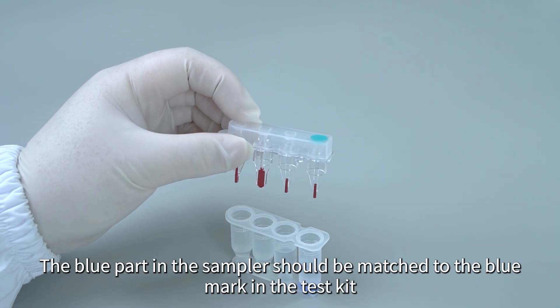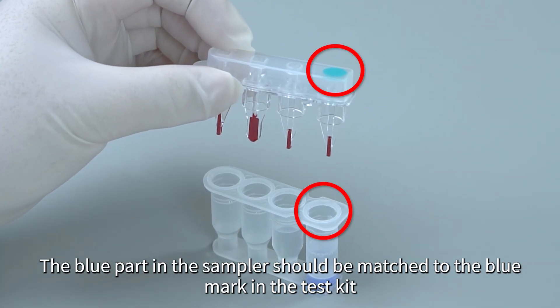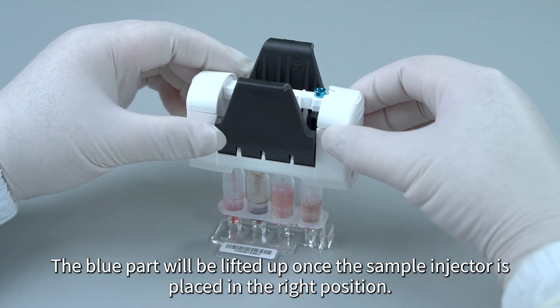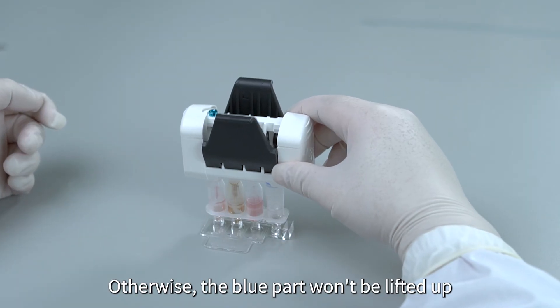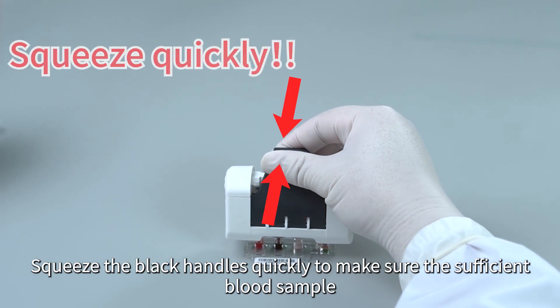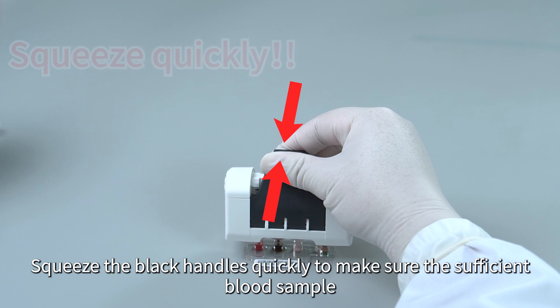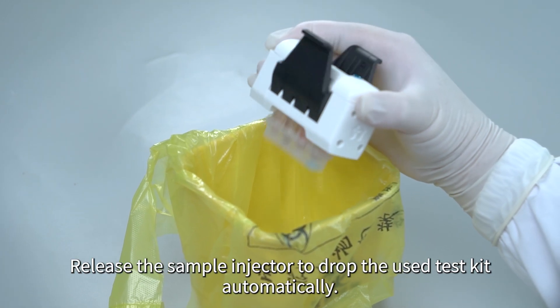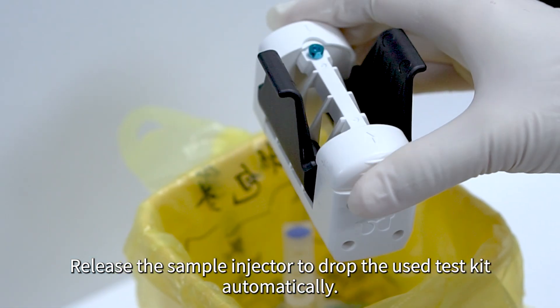ATTENTIONS. The blue part in the sampler should be matched to the blue mark in the test kit. The blue part will be lifted up once the sample injector is placed in the right position; otherwise, the blue part won't be lifted up. Squeeze the black handles quickly to ensure sufficient blood sample and proper chromatographic analysis of the counting chamber. Release the sample injector to drop the used test kit automatically.